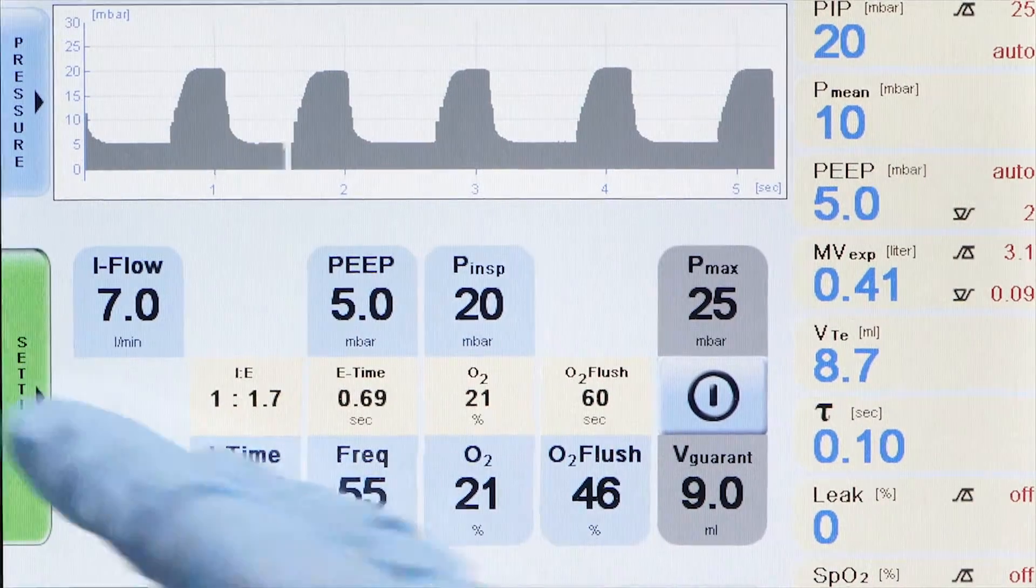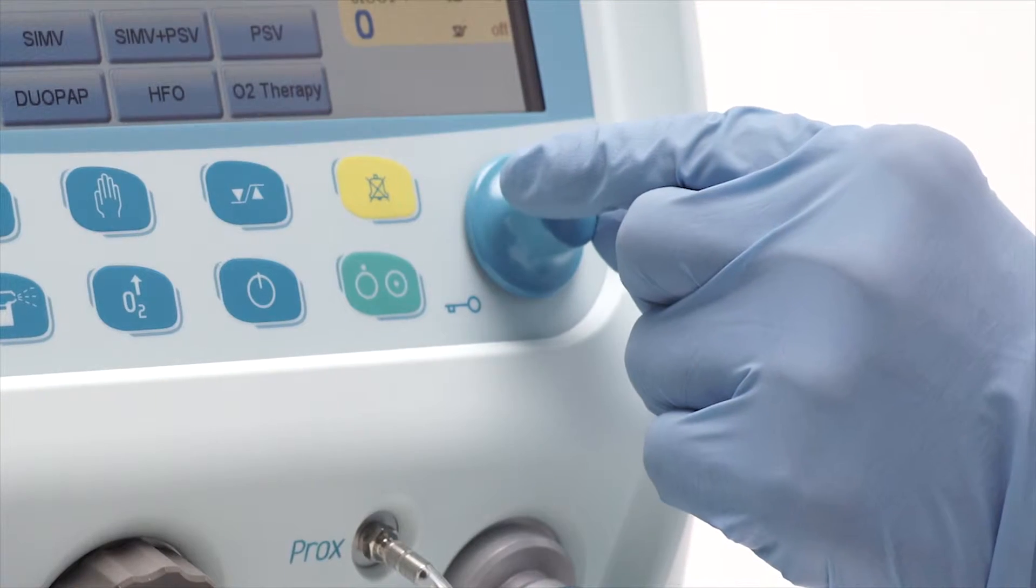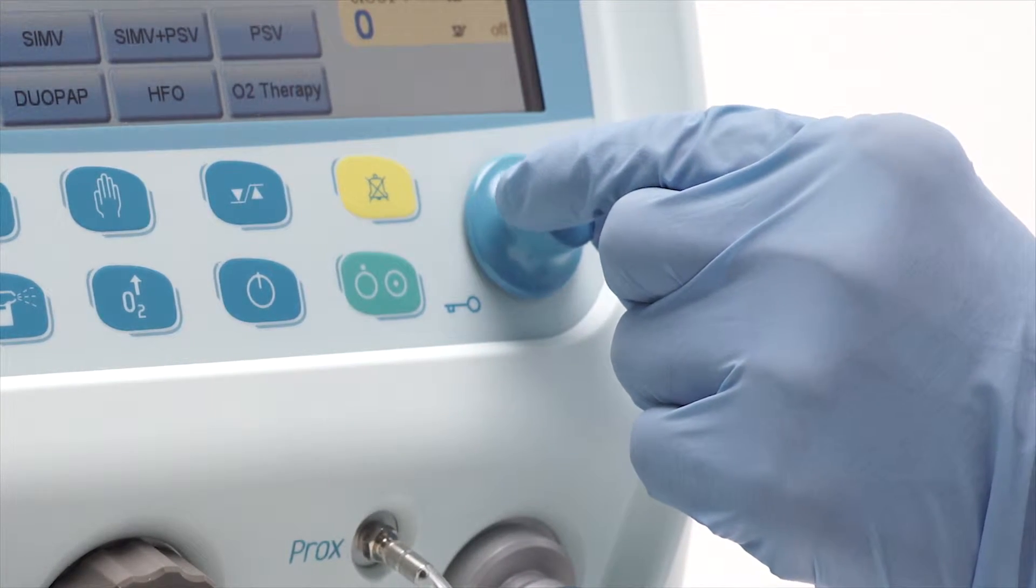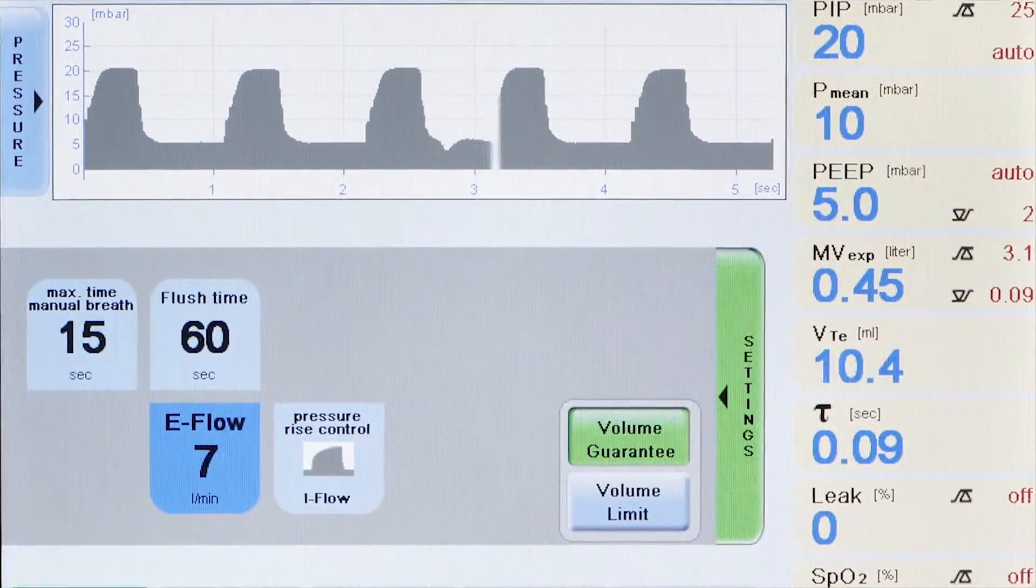eFlow. This should be set either the same as iFlow or about two-thirds of it. It maintains the PEEP level in between the mechanical breaths. For neonates, this is usually set to 6 liters per minute.